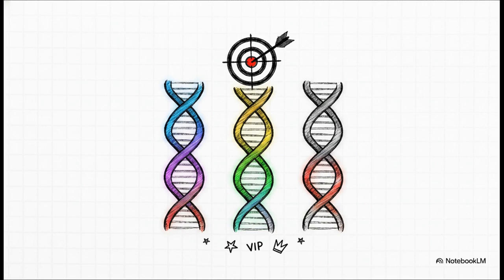Mastering the specific hotspot variants, the gene fusions, and the copy number changes of these specific genes is absolutely non-negotiable for clinical reporting. These are the genes driving the most common cancers, and frankly, they are the ones with the most targeted therapies available today.